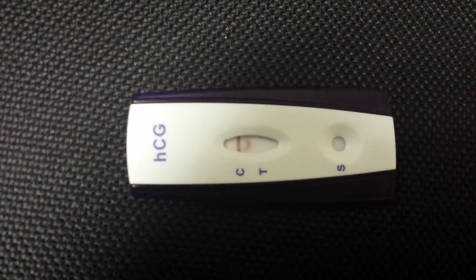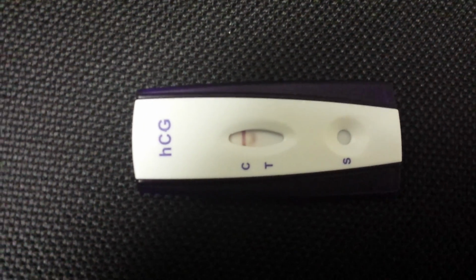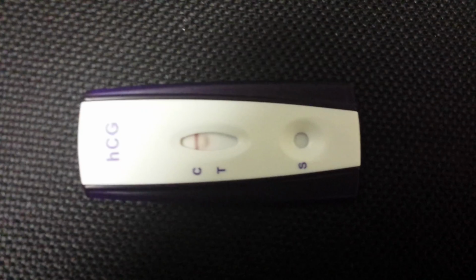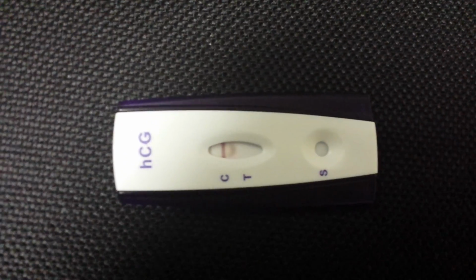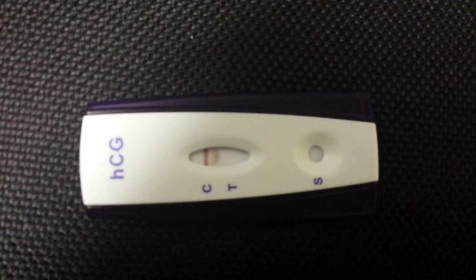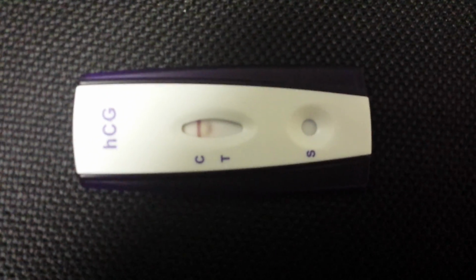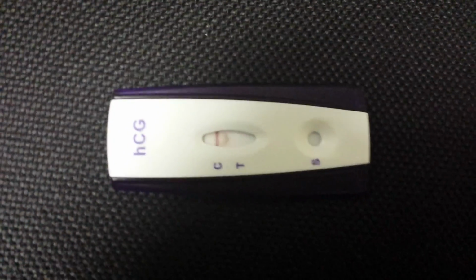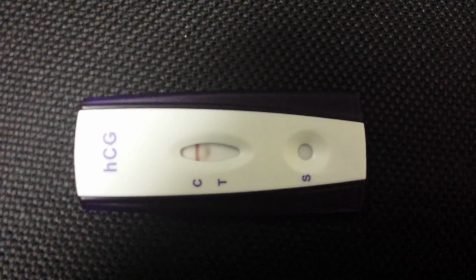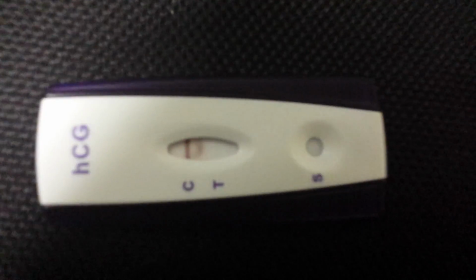Like I said, it's like the pink dye has kind of morphed. It was more of a solid line actually about 15 minutes ago, and it's kind of just morphed into something else. But usually the rule of thumb with evaporation lines is if there's no color to it, it's an evaporation line. And if there's any kind of pink to it, it could be a possible positive. I guess at this point, I just want to know if maybe I had a miscarriage, or maybe a chemical pregnancy, or maybe a tubal pregnancy, which is where something was fertilized and just didn't survive, or, I don't know what it could be, but it's pink.